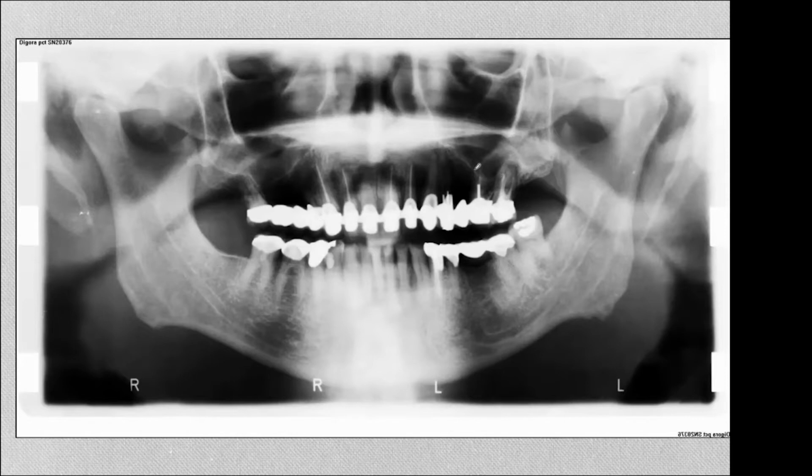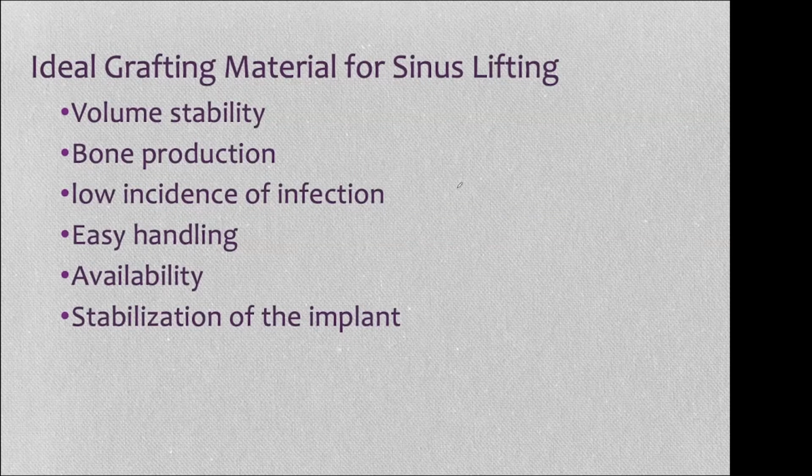And so when we went to do the sinus lift, this is a prime area for adhesions. In other words, the scars between the sinus mucosa and the bone that will be very hard to separate in a surgical approach. And this is where, if we're going to have tears and perforation in a lateral lift, they most often will happen: in an area of multi-rooted teeth that have had infection and or endodontic treatment. So when we are doing a sinus lift, the sinus lift is a graft. The graft just happens to be in the sinus or underneath the sinus cavity per se.